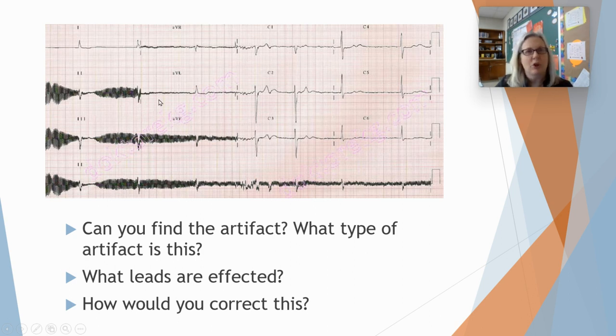Now, what stickers do those coincide with? 2, 3, and AVF. It's the limb leads, right? So we're looking at the limb leads. Something is causing this artifact. And if you said AC artifact or 60 hertz artifact, you are correct.